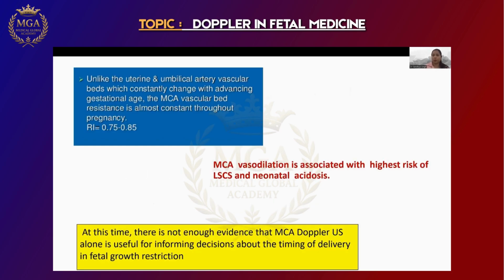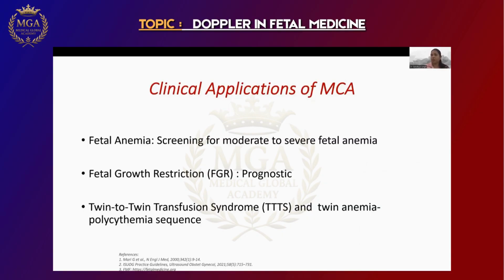Baby wants lots of oxygen. Okay. Now, I told you one more thing we measure, that is the peak systolic velocity. I told you we will discuss anemia. See, anemia is also like hypoxia. When my hemoglobin concentration is low, what does my body do? The body tries to circulate the blood faster so that it can compensate for the lesser amount of blood. Because of that, the peak systolic velocity goes high whenever there is anemia.